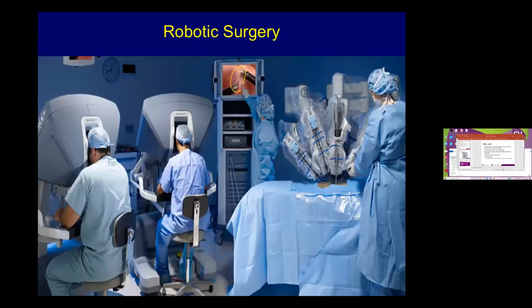Robotic endoscopy has become a standard of care in many surgical laparoscopic related surgeries. For example, in urology, prostatectomy is mostly done by robotic surgery. Gynecological surgery is being done. Many oncosurgeries are being done. However, making flexible fiber optic endoscopy robotic had some technical challenges.